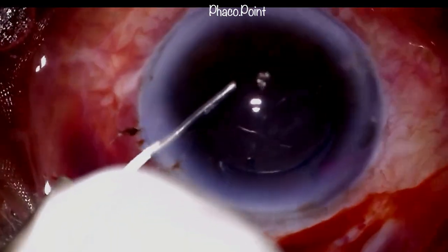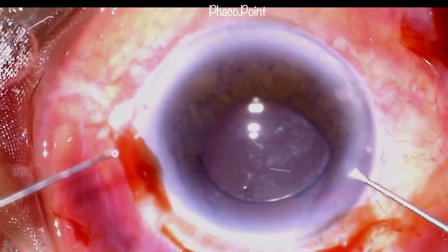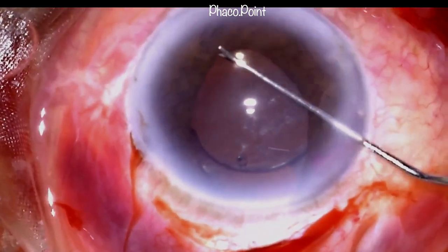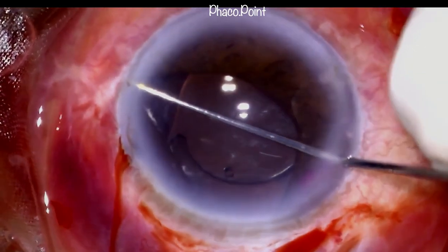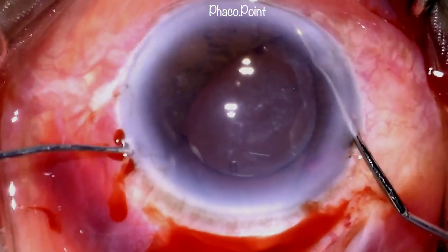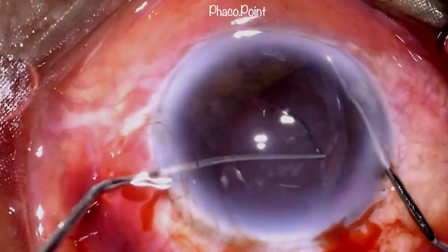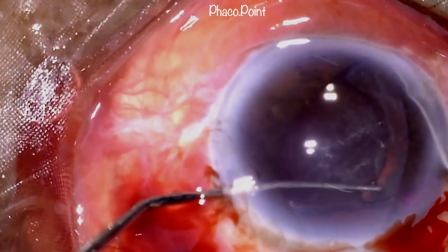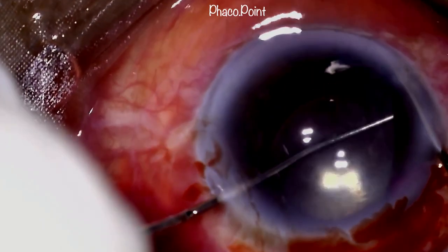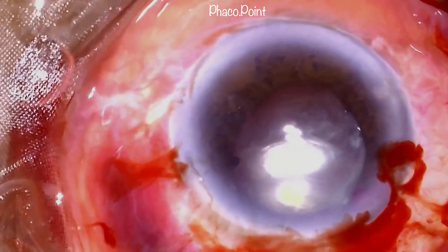I now introduce some viscoelastic into the anterior chamber and then proceed to evaluate the stability of the IOL. What I can see is that the IOL seems to be quite stable within the capsular bag. However, I choose to now rotate the IOL into the ciliary sulcus to afford slightly more stability. Now, I have a resultant stable rigid IOL in the ciliary sulcus.